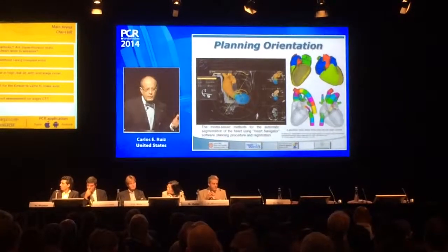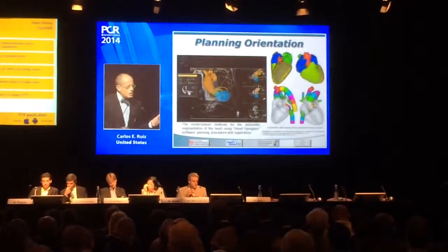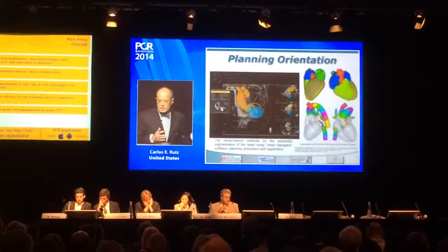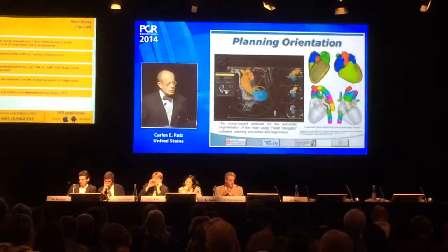Performing one single phase of the entire cardiac cycle. Number two, this is a pre-acquired image, so there is a time lag between the acquisition and the time that you perform the procedure. Number three, the position of the patient was not the same.